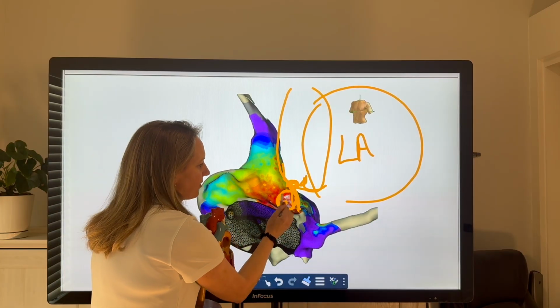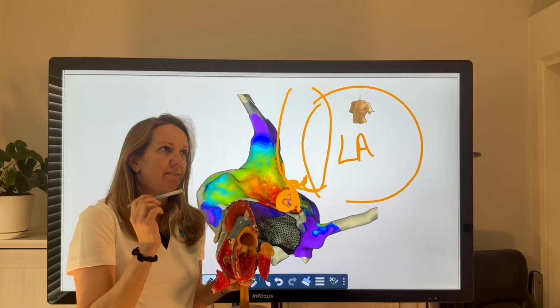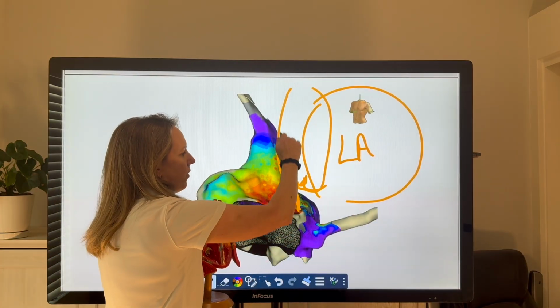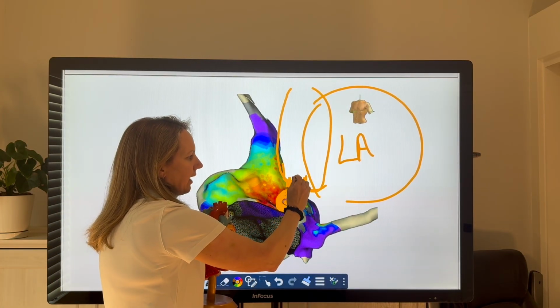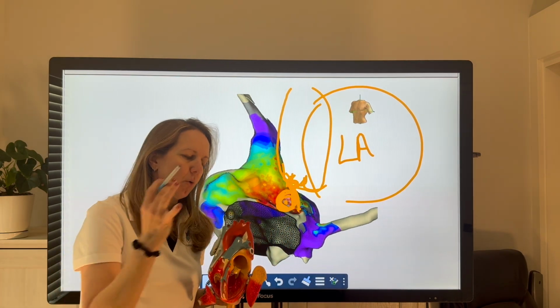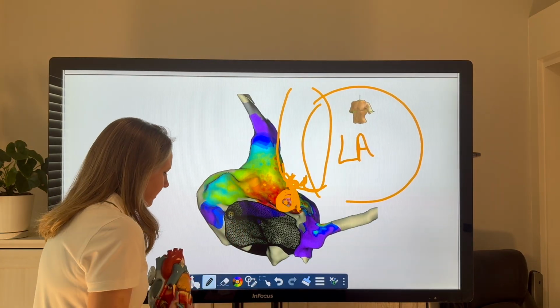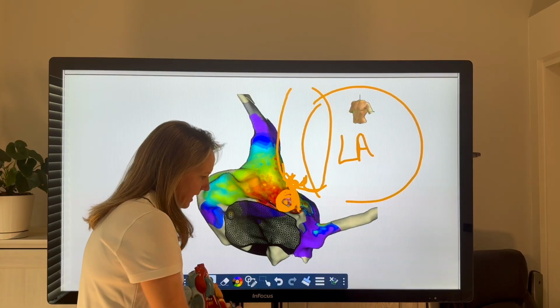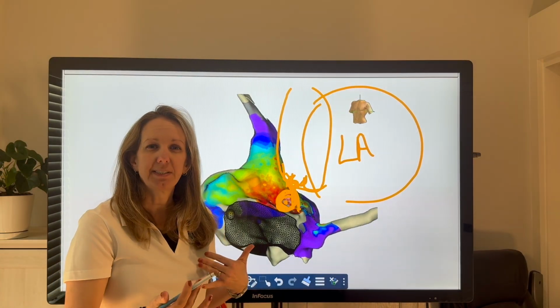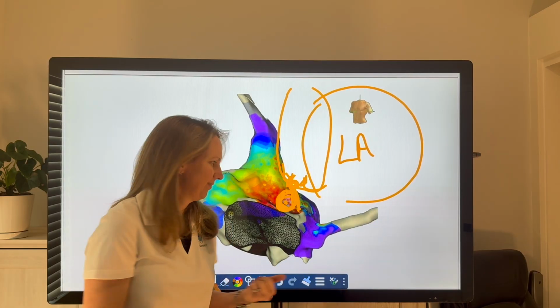If the atrial tachycardia is mapping out to the bundle of His, very often this is a non-coronary cusp atrial tach. And if we burn in that non-coronary cusp, we will get that tachycardia. So in this instance, the physician decided to talk to the patient about further risks and come back to complete that ablation at a later time.